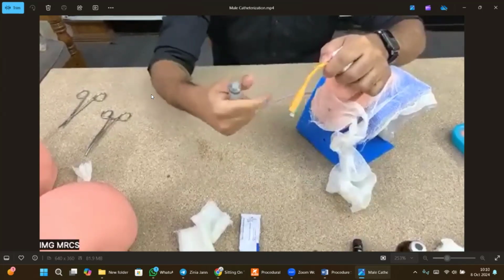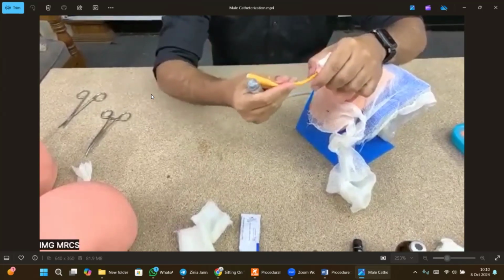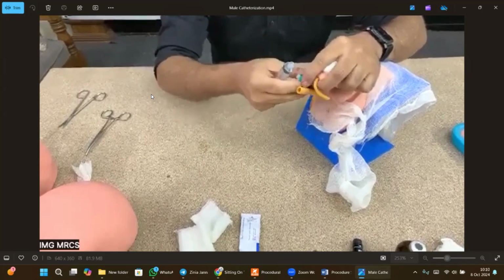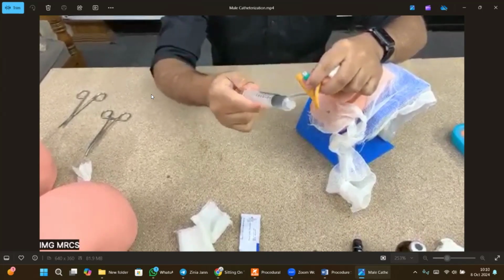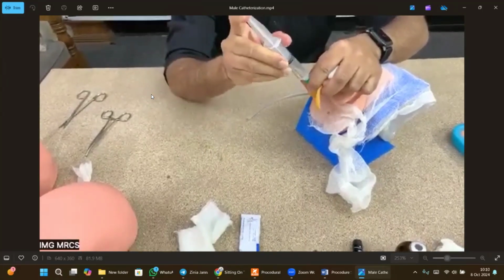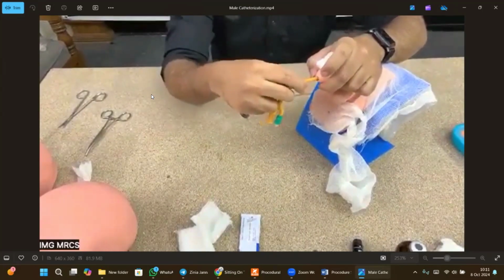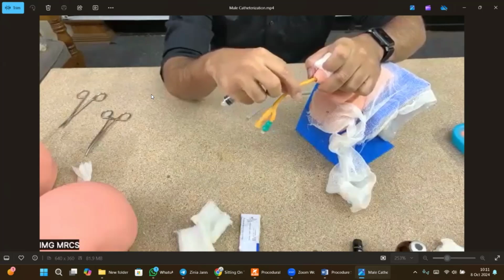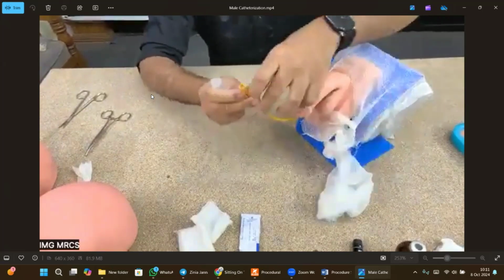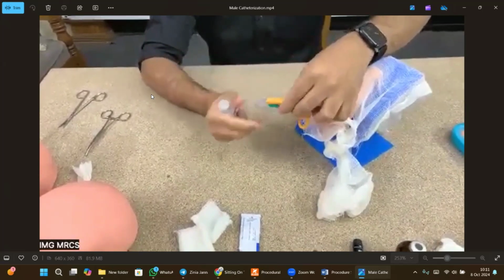Okay, so now we are seeing there is some urine coming out. So what we need to do is pull the catheter a bit to see whether there is resistance or not. After inflation, correct. So at this point, we have to inflate the balloon, right? And then we are going to pull the catheter so that we will see there is some resistance. And at this point, we have to connect the urobag here, right? Just like this, we are going to connect the urobag, okay?